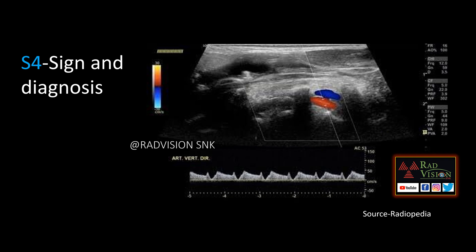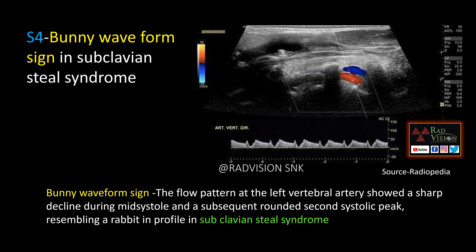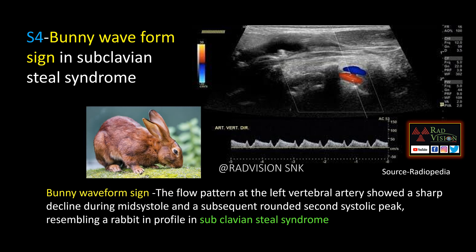Next case — here you can see the vertebral artery Doppler. Normally there is peak systolic forward flow followed by diastolic flow, but here the normal systolic uptake is interrupted and there is a second systolic peak at the end of systole and beginning of diastole. This is called the bunny waveform sign. The flow pattern shows a sharp decline during mid-systole followed by a rounded second systolic peak, both together resembling a rabbit in profile view. Remember: bunny waveform sign in subclavian steal syndrome.